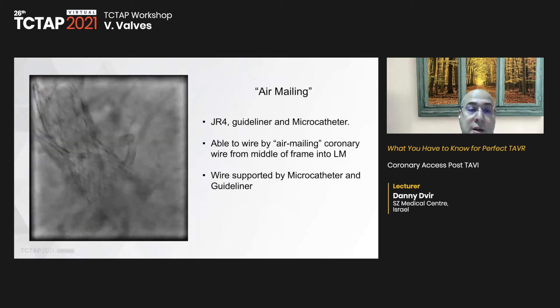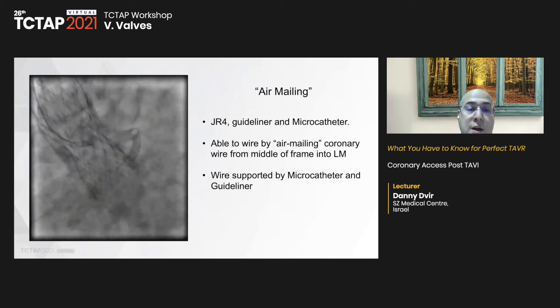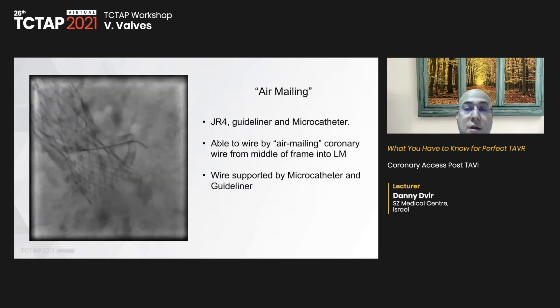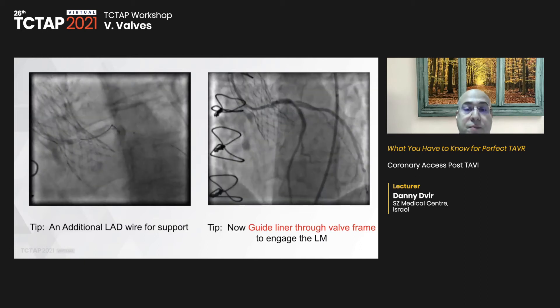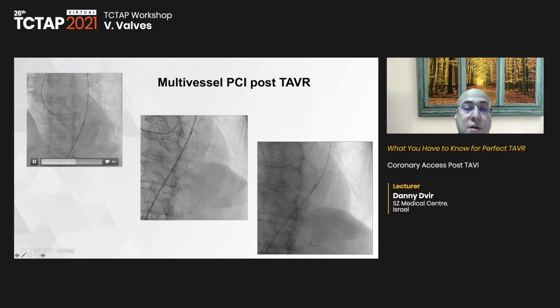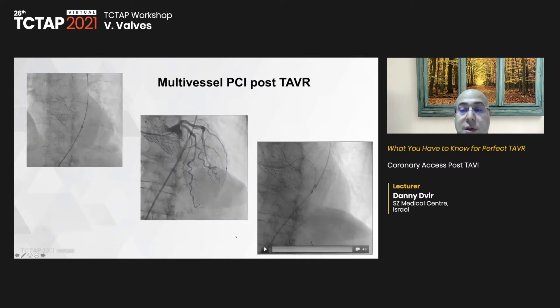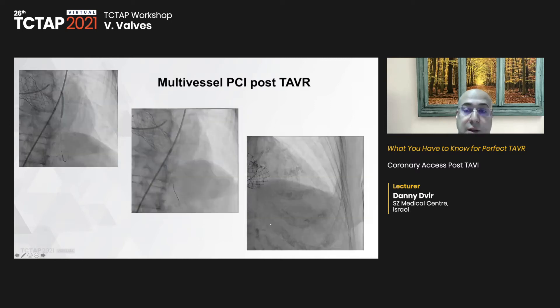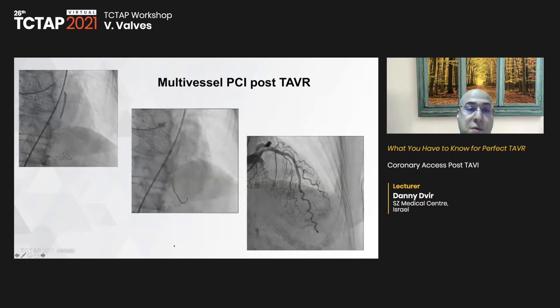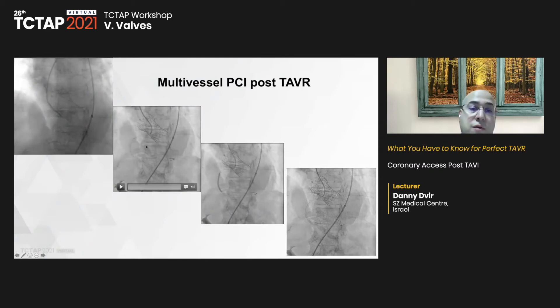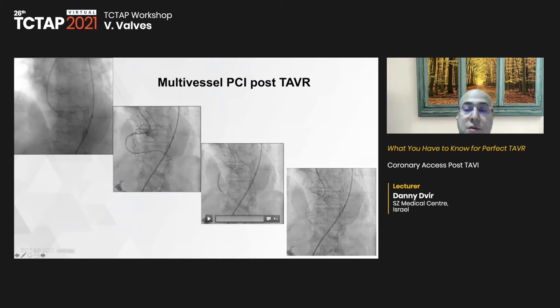Here is an example of air-mailing — wiring the coronaries without real engagement of the coronary ostium. Later you can bring equipment over that wire and advance a guide extension for better support. Here is a multi-vessel PCI example, with coronary ostia engagement led by a 0.035 wire. That patient had rotational ablation of the mid-LAD, then the LAD was opened successfully, followed by PCI of the right coronary artery — engagement performed behind the frame of a CoreValve device.